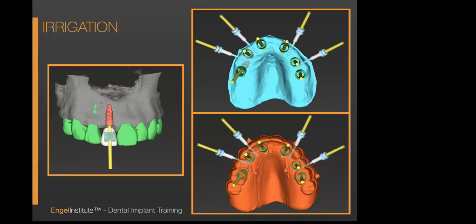You might ask yourself, especially if you're listening to this and you've done a lot of implants, well, I'd freehand that one. Well, yeah, so would I. But I'm gonna tell you why I didn't. Because this patient had been missing this front tooth for 3 to 4 years.